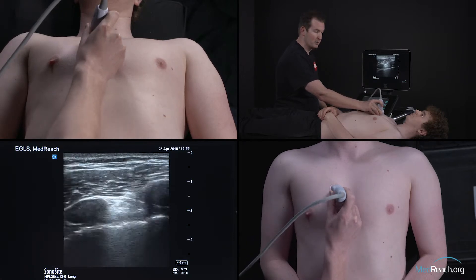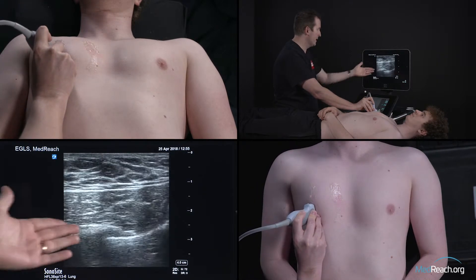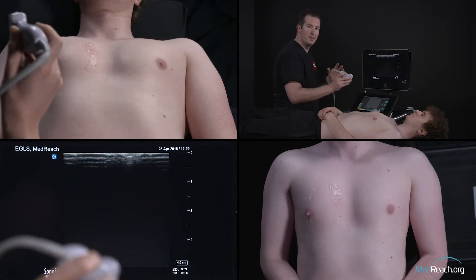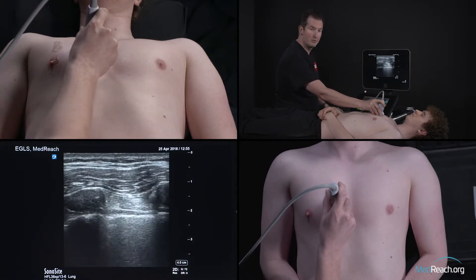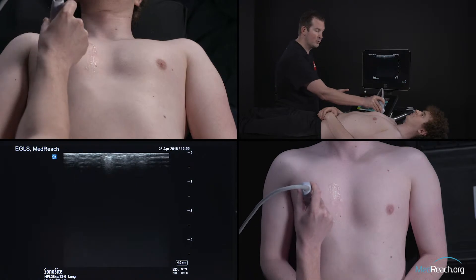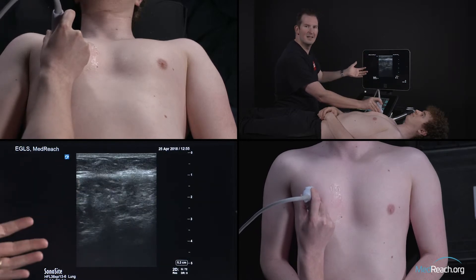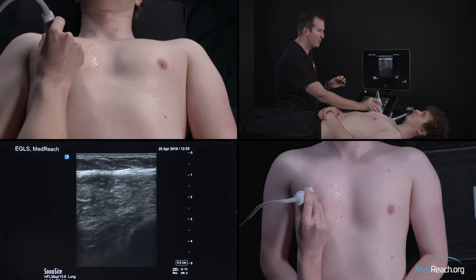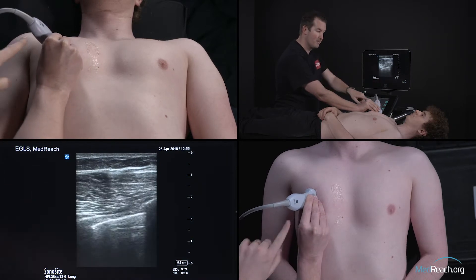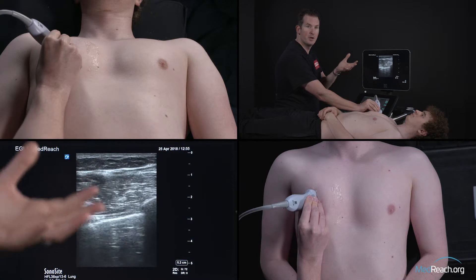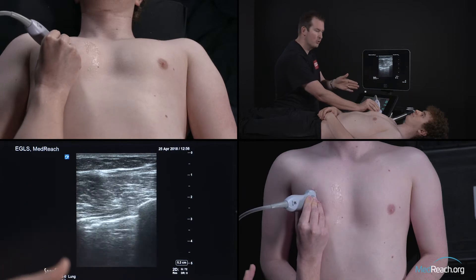So, four interrogation points: upper half medial, upper half lateral, lower half medial, lower half lateral — a pretty rapid exam. You just assess if there's lung sliding or not. What we typically see a lot of people doing is staying very perpendicular to the skin when medial, but keeping the same position as they go lateral. As I tilt the probe laterally, at some point — voilà — I have the pleura and the ribs. That's because now the probe is perpendicular to the pleura and ribcage. It curves pretty rapidly, so do think to curve your probe appropriately when going to the lateral side.